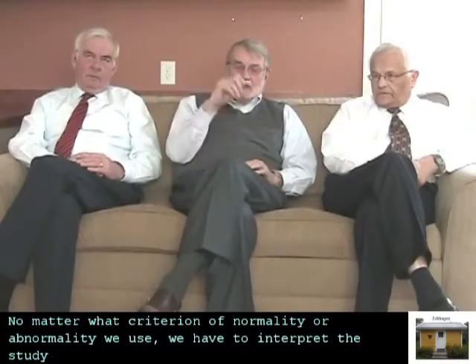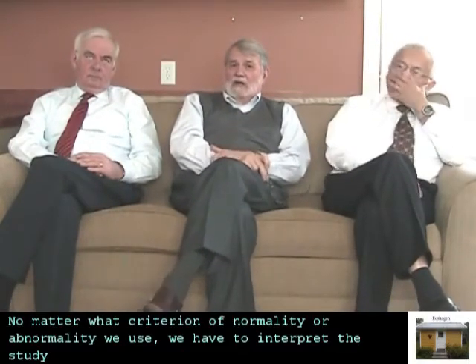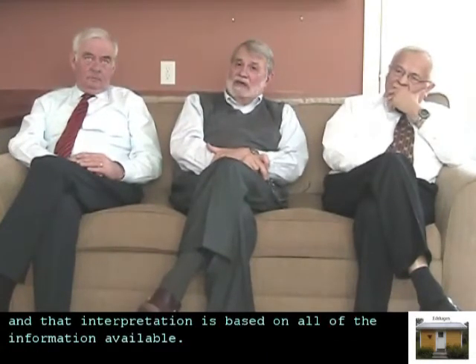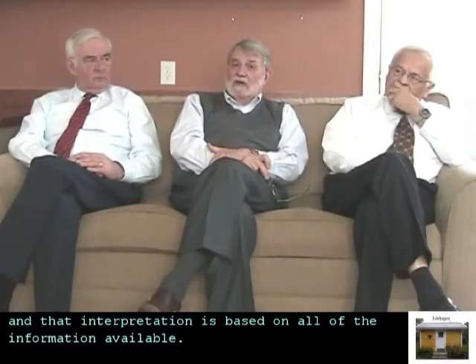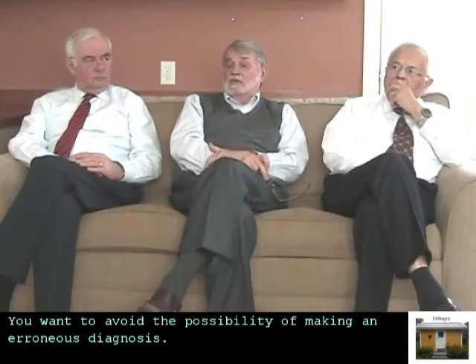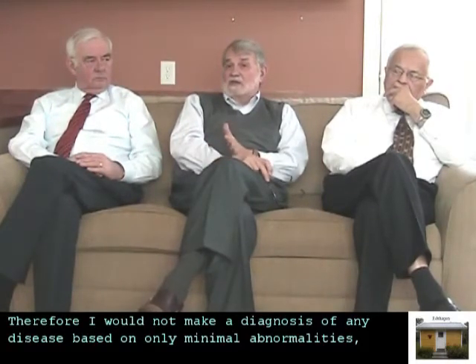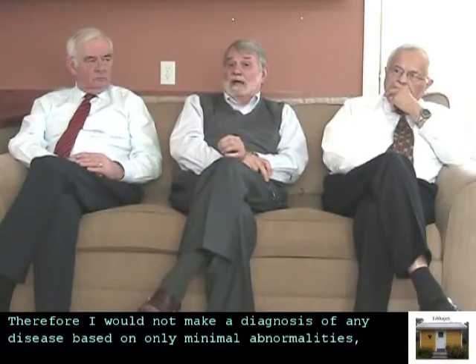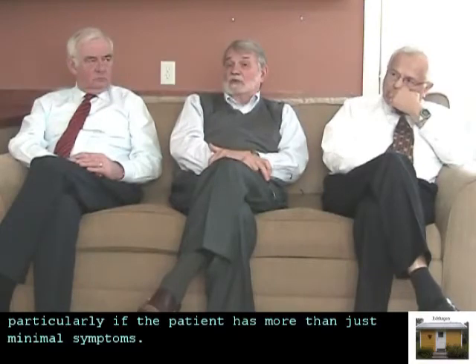No matter what criterion of normality or abnormality we use, we have to interpret this study, and that interpretation is based on all of the information available. And you want to avoid the possibility of making an erroneous diagnosis, and therefore I would not make a diagnosis of any disease based on only minimal abnormalities, particularly if the patient has more than just minimal symptoms.